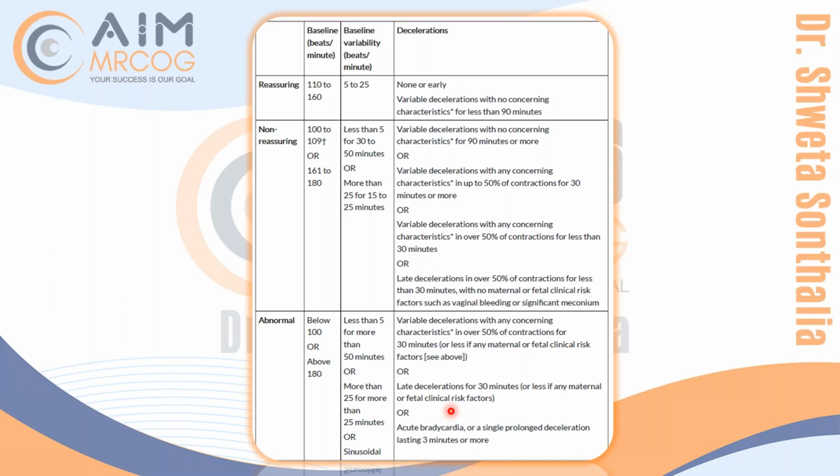Epidural anesthesia you gave, suddenly there will be hypotension. That's why we preload the women. But in spite of preloading, sometimes there will be hypotension. And you might see either bradycardia after epidural, or you might see deceleration after epidural. But it will improve once you replace the fluid. It is not because of the baby's chronic hypoxia. It is because of the maternal condition. So CTG is not only related to the baby, but also to the mother. If the mother is having hypotension, the CTG will show problems. Once you correct that, it will disappear.